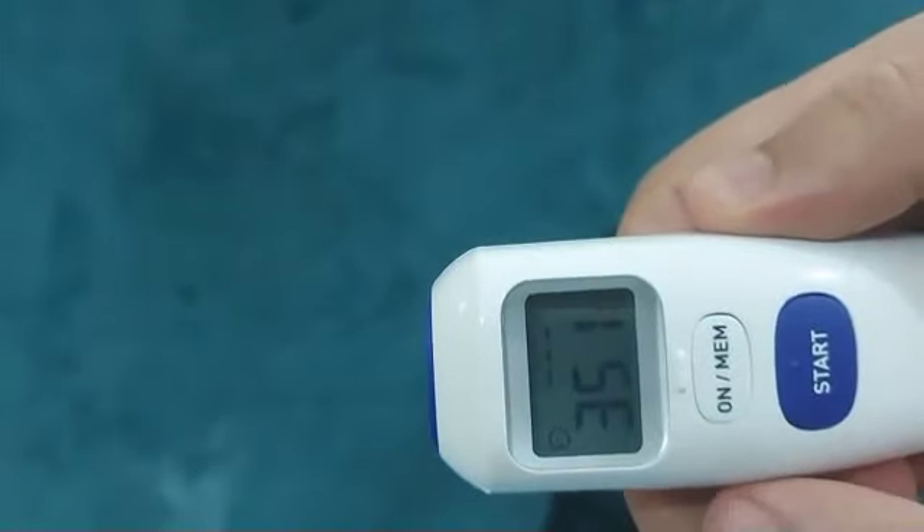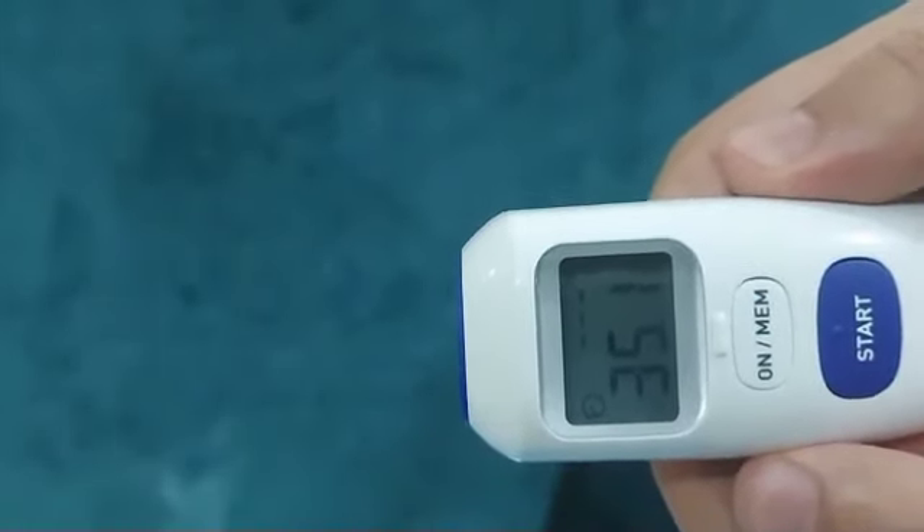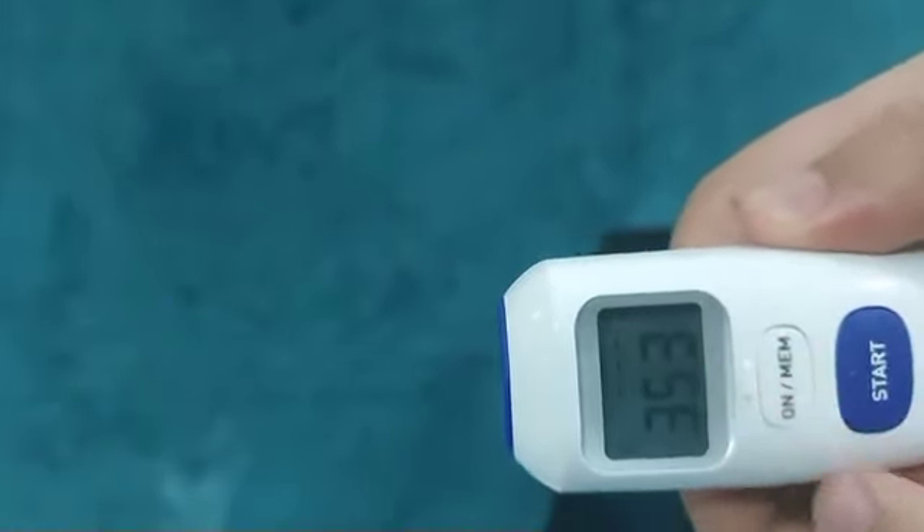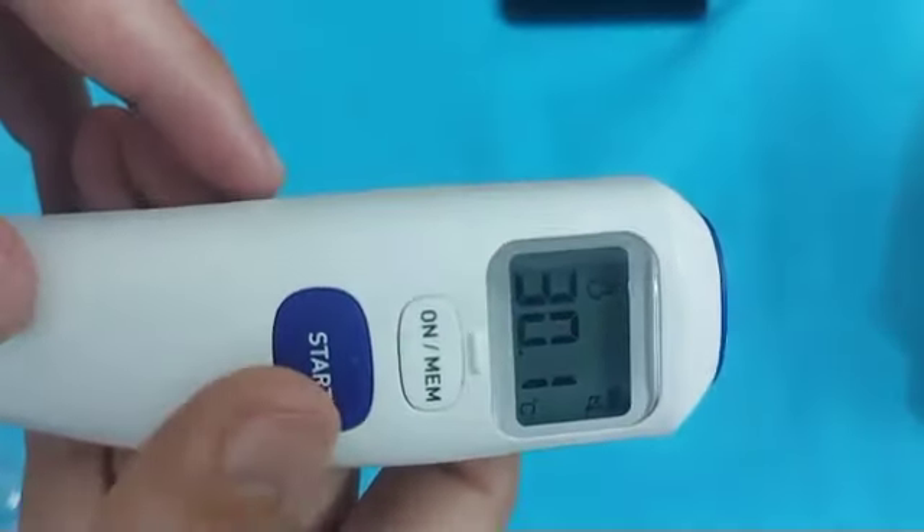The Omron Gentle 720 can save temperature readings up to 25. To check memory, push the Memory button.